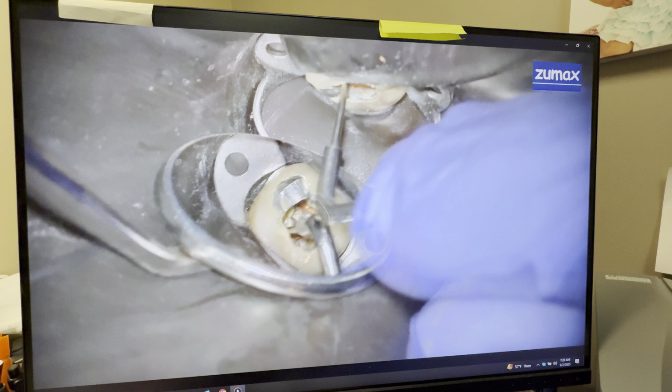All right. Seems like I got a stable reading. So I already regained patency in the mesiobuccal, regained patency in the mesiolingual, located a missed distal buccal, and of course removed pretty much all the gutta-percha by dissolving the gutta-percha in chloroform.